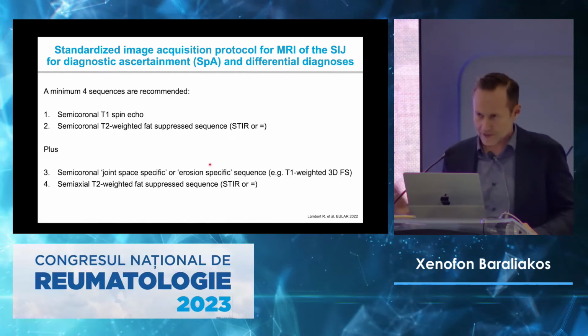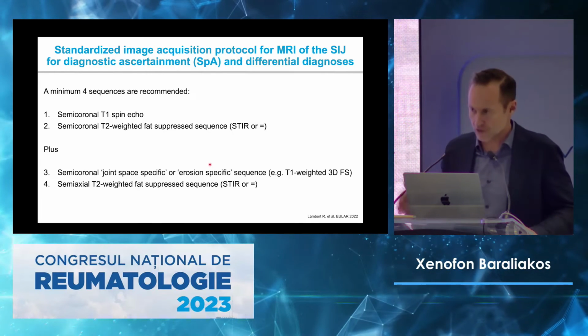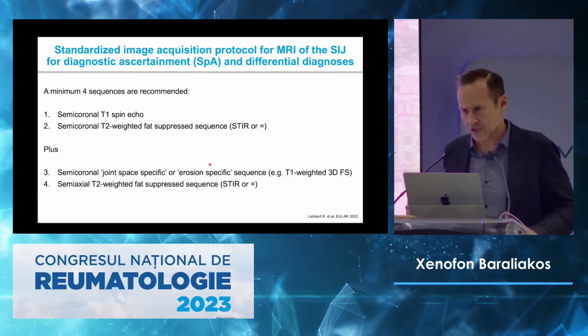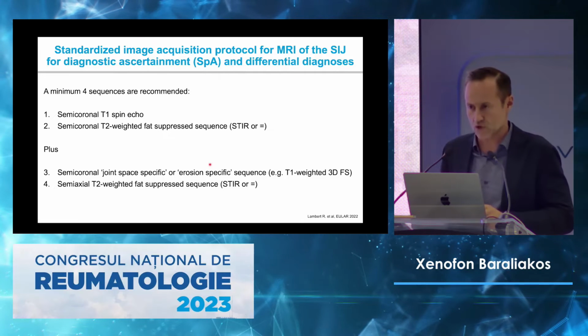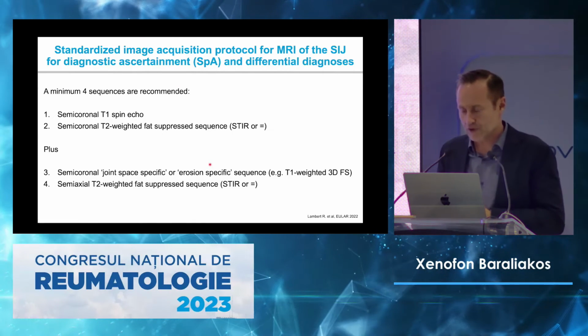So there are some publications that show that the sequence is inflammation, fat, syndesmophyte. And there is a more recent publication that came out just recently. I was part of it, so I do know where the data come from. And there are also other publications that show that fat is not needed. My opinion is that fat is needed.